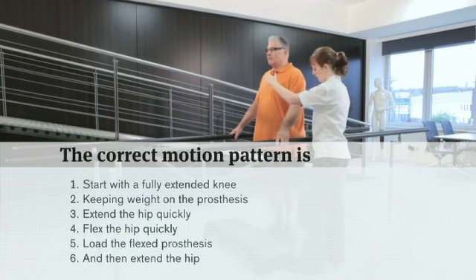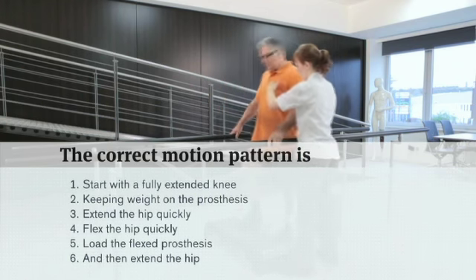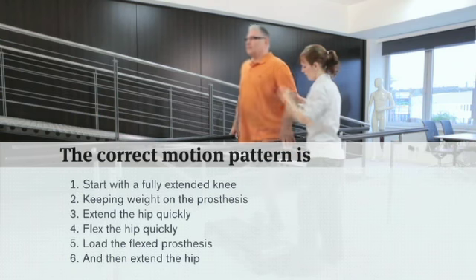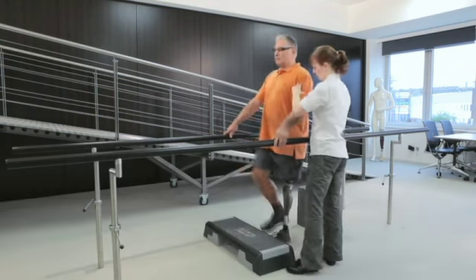Start with a fully extended knee, keeping weight on the prosthesis. Extend the hip quickly, then flex the hip quickly with a snapping motion. Load the flexed prosthesis. It will be locked so the load can be applied. And then extend the hip.